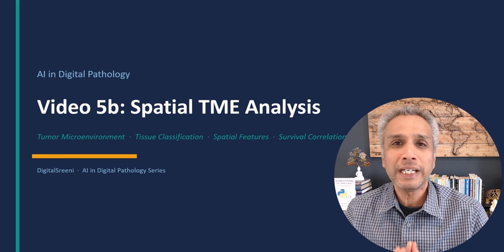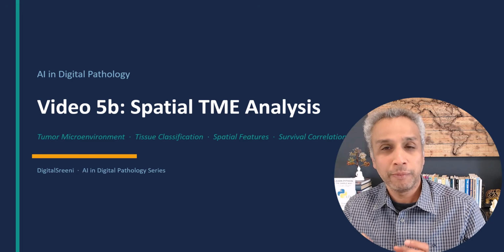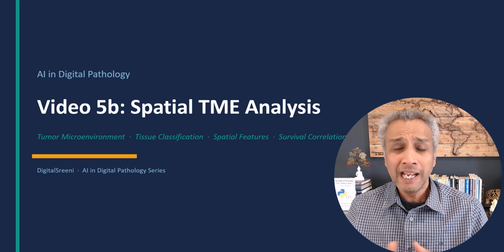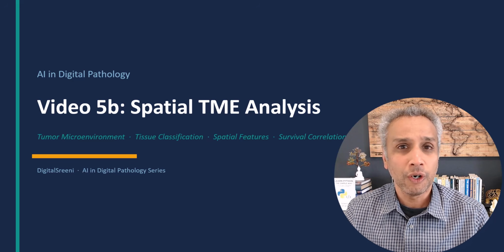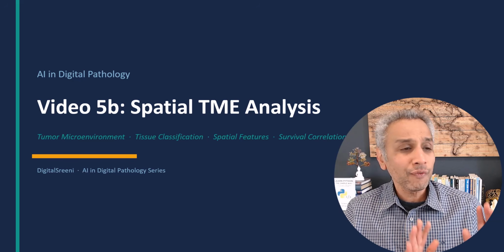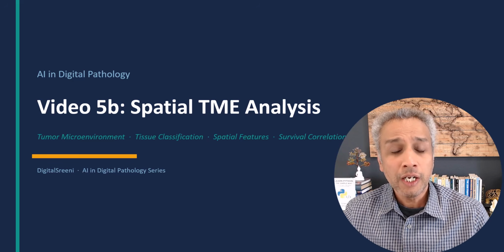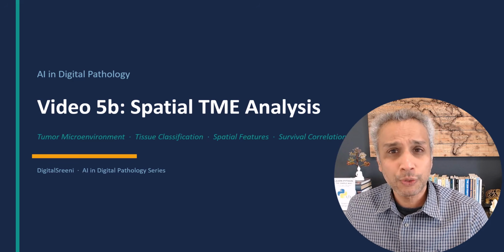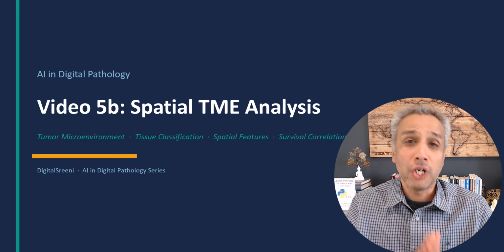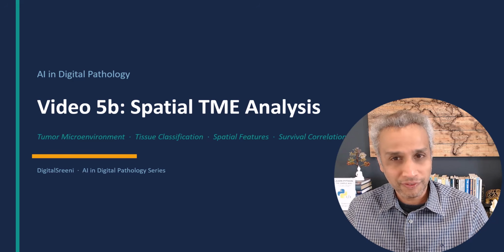We have 427 colorectal cancer whole slide images. Well, we don't have the actual images; we have the embeddings, once they're converted to this 1024 vector. This dataset is coming from SurGen, and SR386 is the dataset. So instead of just exploring what the embeddings look like, we are asking a clinical question here: does the spatial organization of the tissues around a tumor predict whether a patient survived 5 years or not? And why 5 years? Because we have that information for all of these slides.